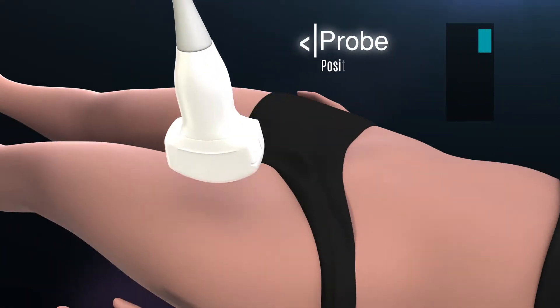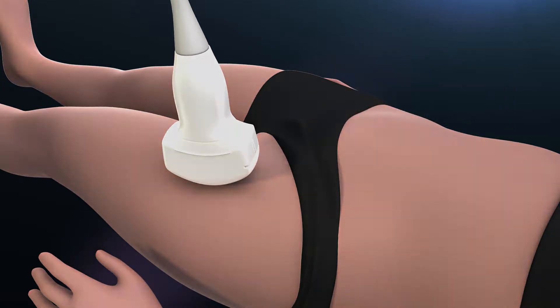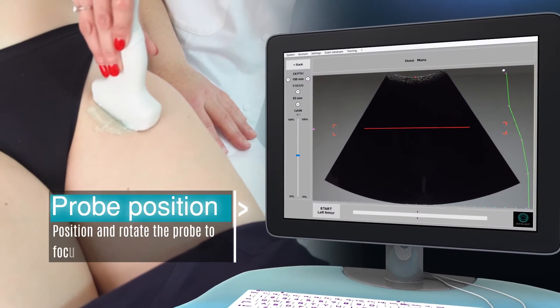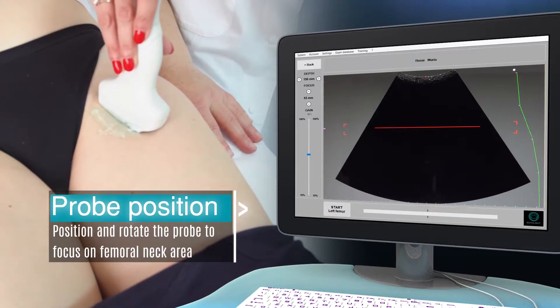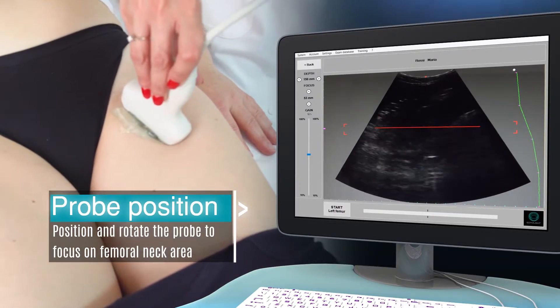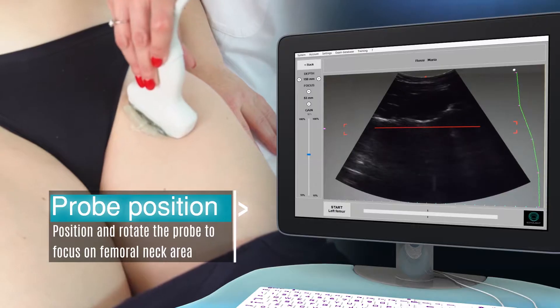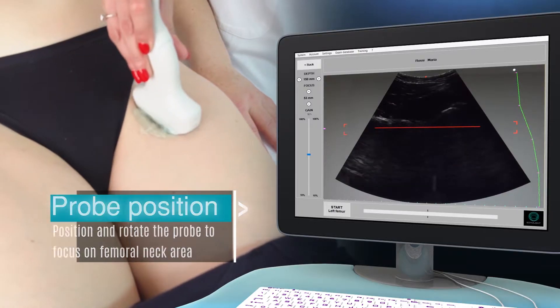Position the probe on the femoral neck area parallel to the femoral axis with the indicator towards the patient's face. Starting from the external part of the hip, move and slightly rotate the probe towards the inner part to view the femoral head, neck and trochanter.